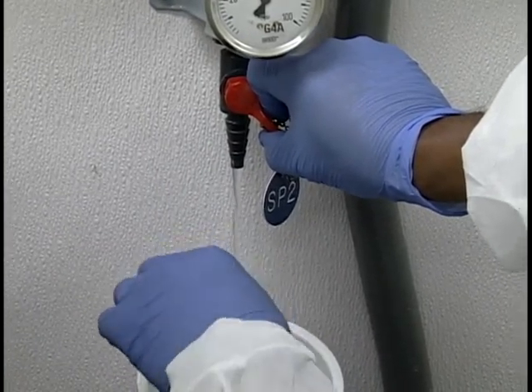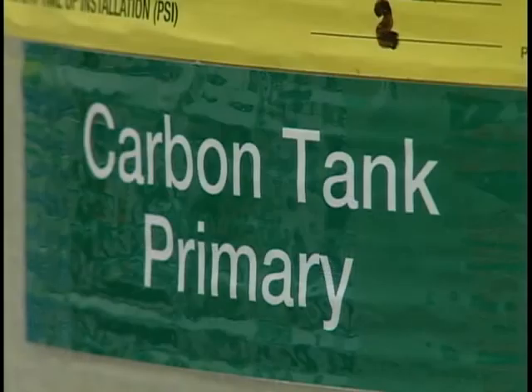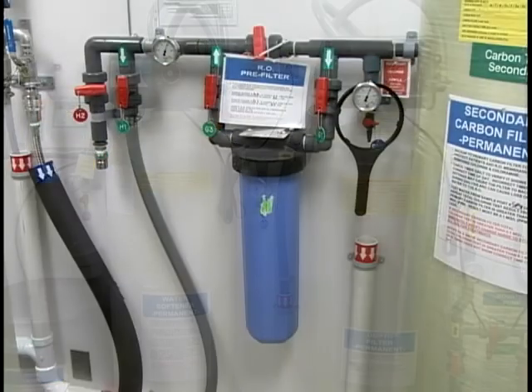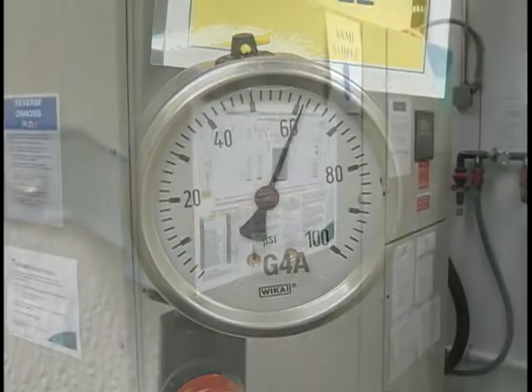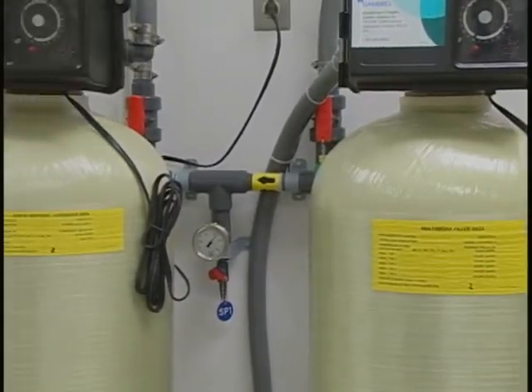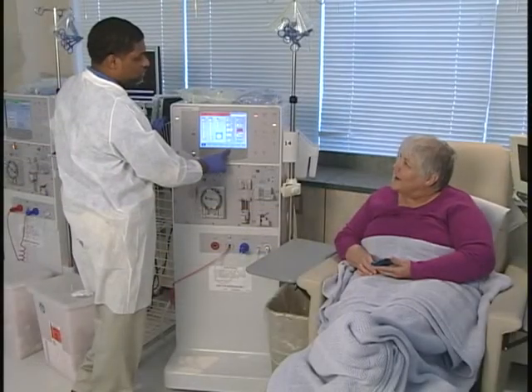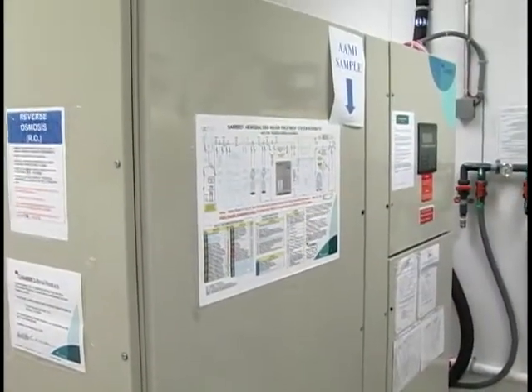While all water treatment rooms will not be configured alike, the equipment you will observe as part of your survey includes 2 carbon filtration tanks, other tanks as required by the system manufacturer, filters, sample ports, gauges, and reverse osmosis, RO, or deionization systems. The proper removal of free chlorine and chloramine from the water used for dialysis is necessary to protect hemodialysis patients from red cell hemolysis, as well as to prevent degrading some types of reverse osmosis dialyzer membrane materials.